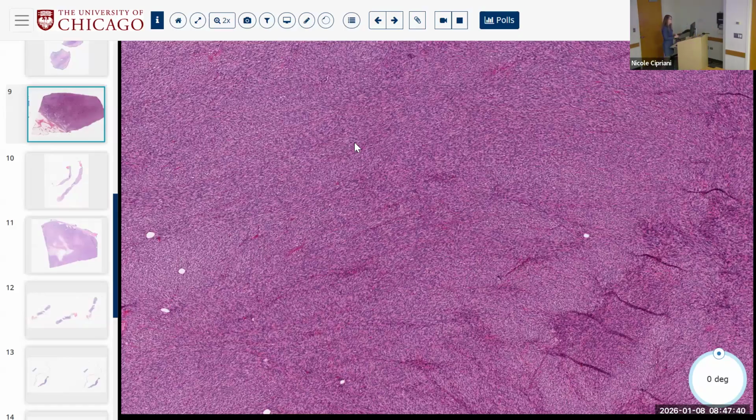Okay. All right. Questions? Yeah. For a fibrosarcoma with no known history or evidence of a DFSP precursor, would retention of the fusion indicate, okay, maybe it was from a DFSP, versus if you saw fibrosarcomatous morphology from an undifferentiated part, you wouldn't have the fusion?